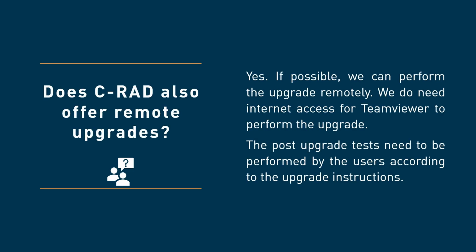Do you also offer remote upgrades for c4D? Yes, of course. The c4D software upgrade can be performed remotely. We just need internet access to the Catalyst or to the Sentinel clients, and of course to the c4D server, if it's a dedicated server or a virtual server. Still, there are some tests to be performed after the upgrade, and these need to be done by someone who's on site. These tests basically check the system for its full clinical operation after the upgrade and consist of performing a daily check, loading a patient, etc.